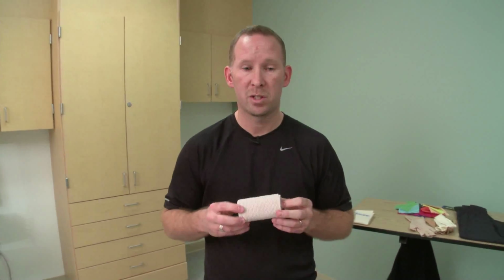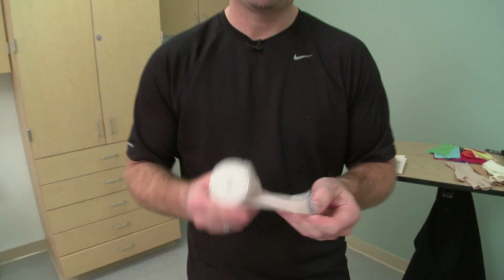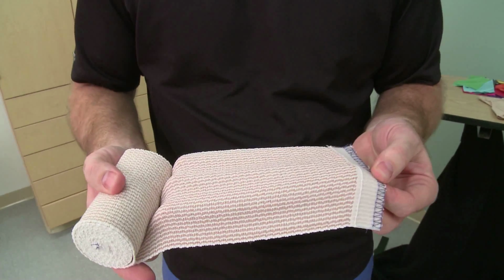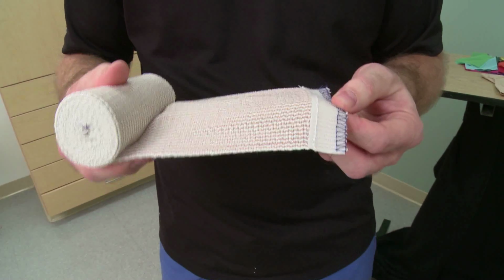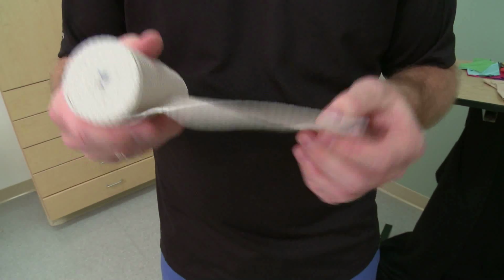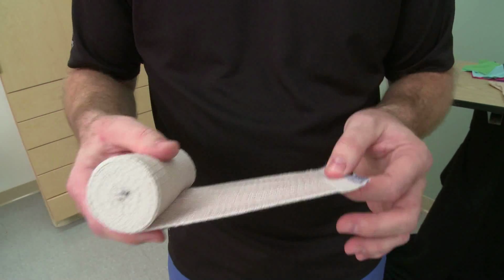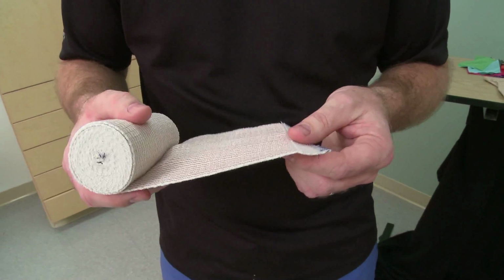Sometimes a patient will wear ACE wraps early in their recovery process. This may include when a person first leaves the hospital and goes home. An ACE wrap is something that many people are familiar with, but often it can be put on wrong, so it's important to know that an ACE wrap must be put on in a fashion such that the pressure is smooth throughout to reduce the risk of skin injury.